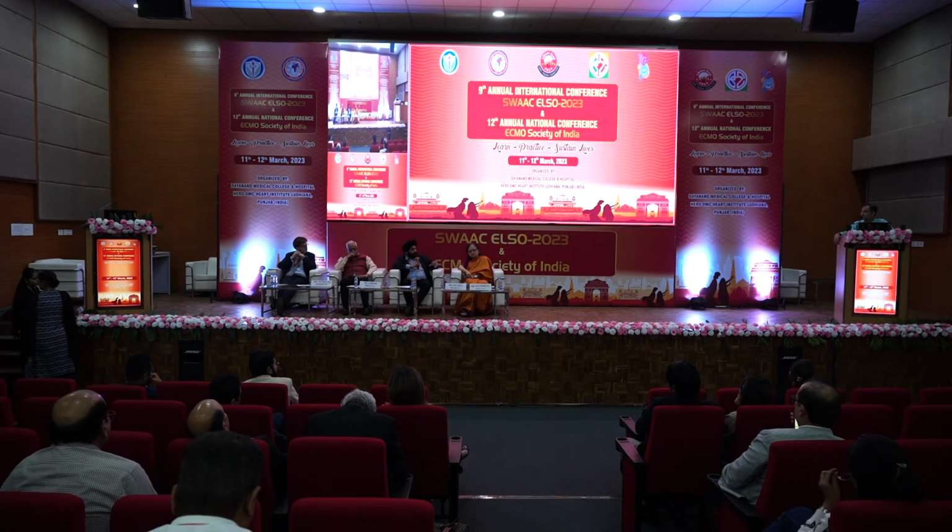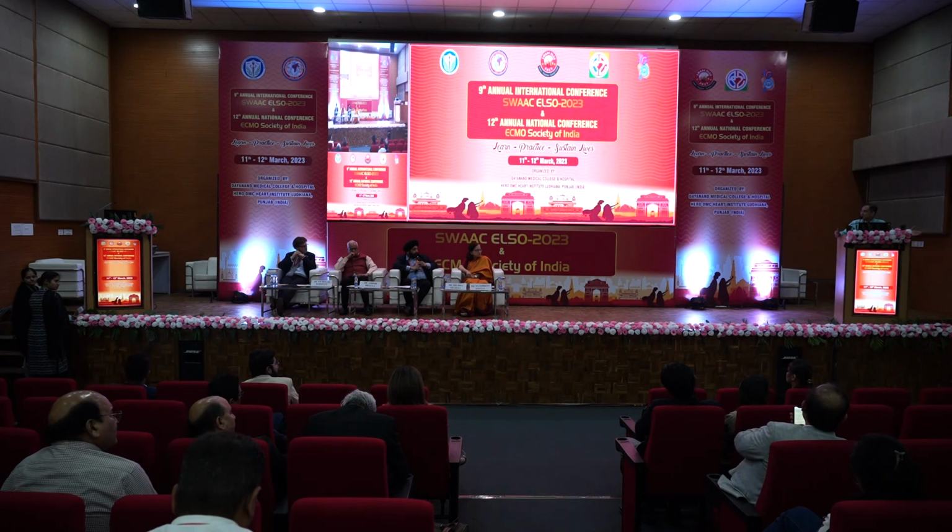So what do you suggest? Is early proning better or late proning? So I think it will depend. There is no data to say early is better or late is better, but I think it will depend on how the lung compliance is behaving.